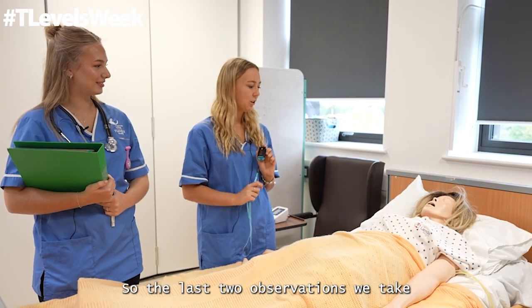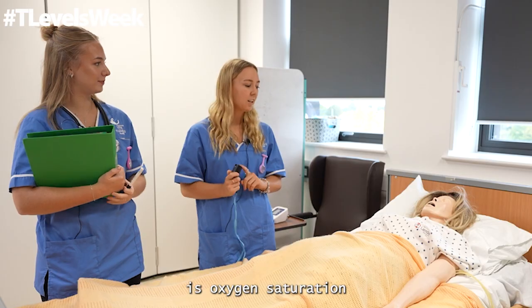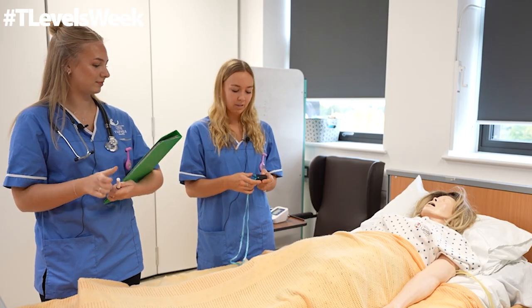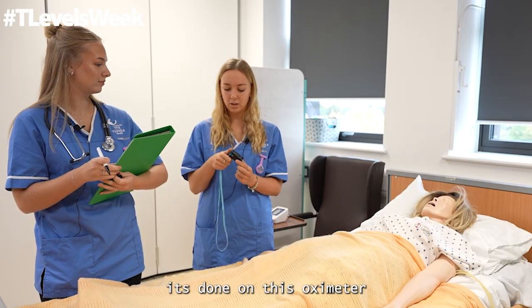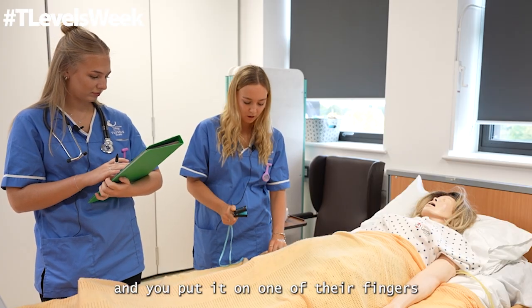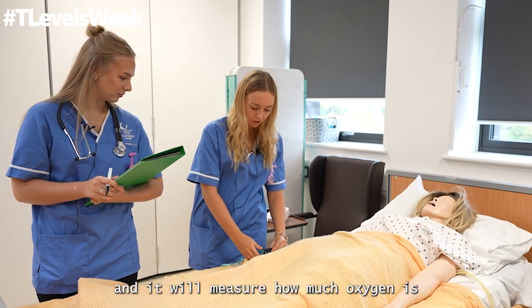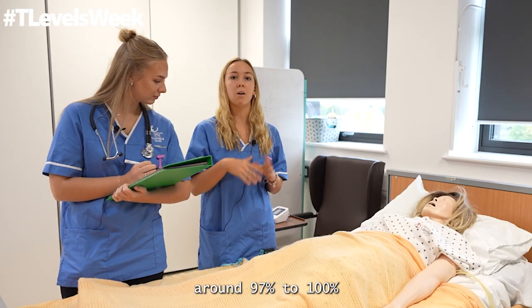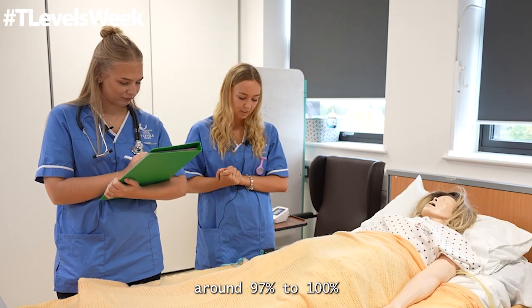So the last 2 observations we take are oxygen saturation and the breathing rate. Oxygen saturation measures how much oxygen is in the blood. This is a really simple one to do. It's done on this oximeter and you put it on one of their fingers and it will measure how much oxygen is in the blood. So the average score we're looking for is around 97% to 100%.